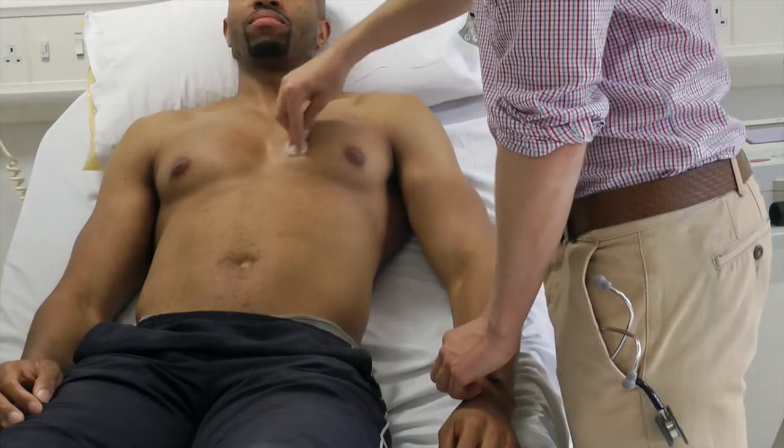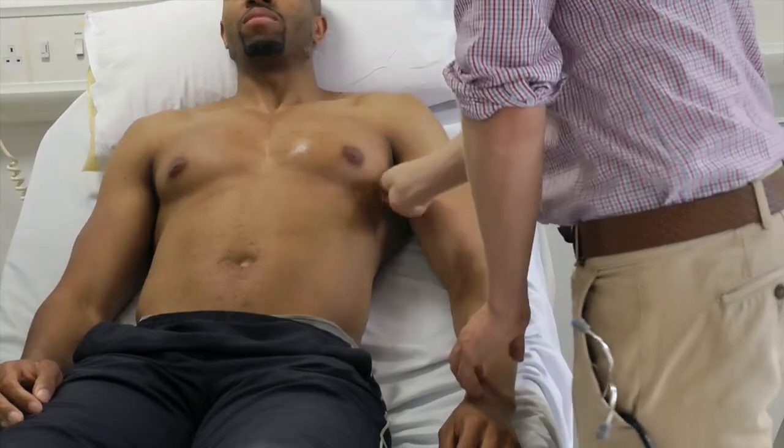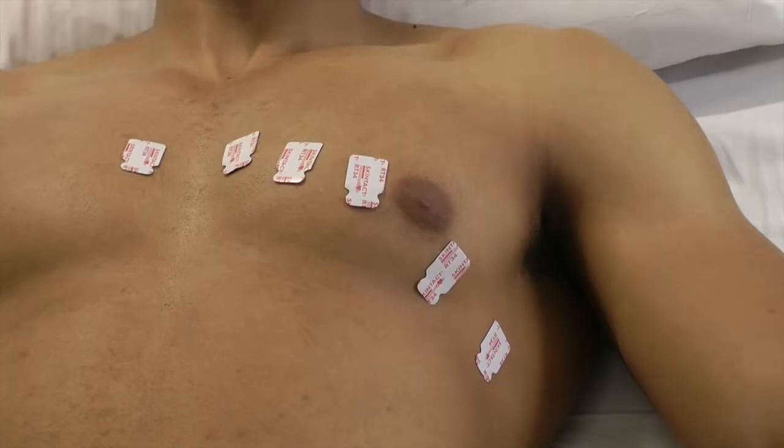You may need to clean the chest or shave it if it is particularly hairy, to maintain good contact with the ECG stickers. Position the stickers as shown.